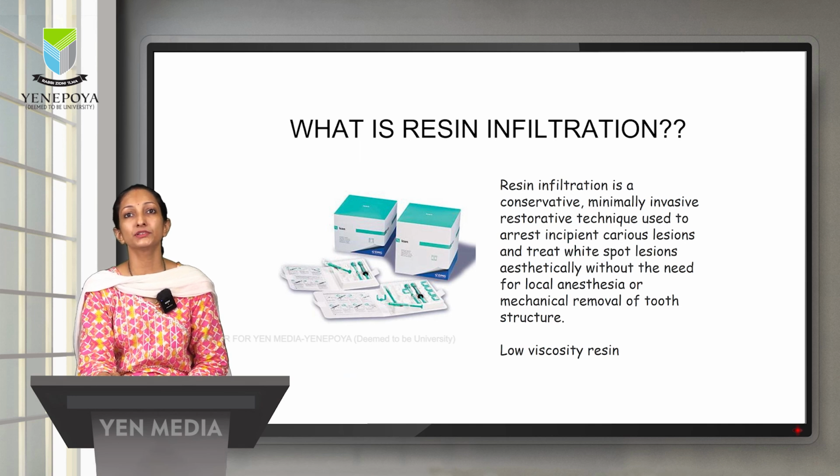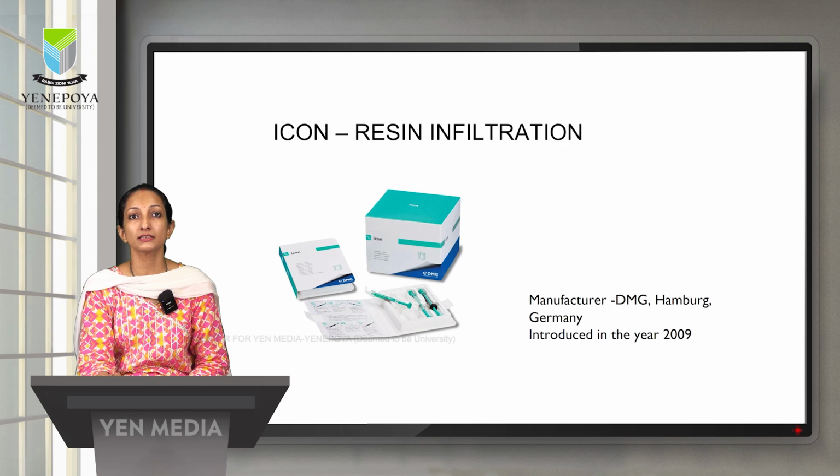Now, what is resin infiltration? Resin infiltration is a conservative, minimally invasive restorative technique used to arrest incipient carious lesions and treat white spot lesions aesthetically without the need for local anesthesia or mechanical removal of tooth structure. It is a low viscosity resin.